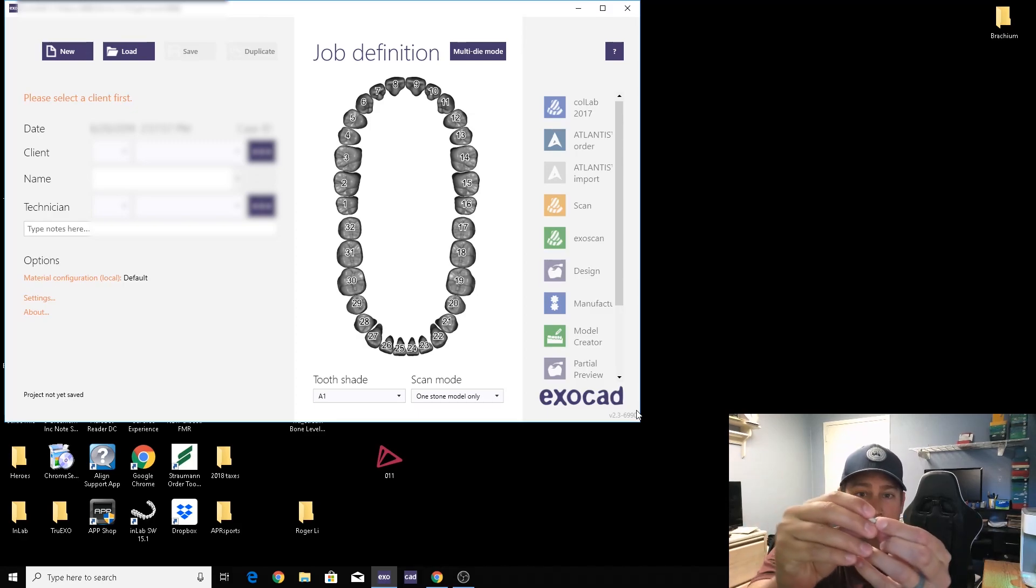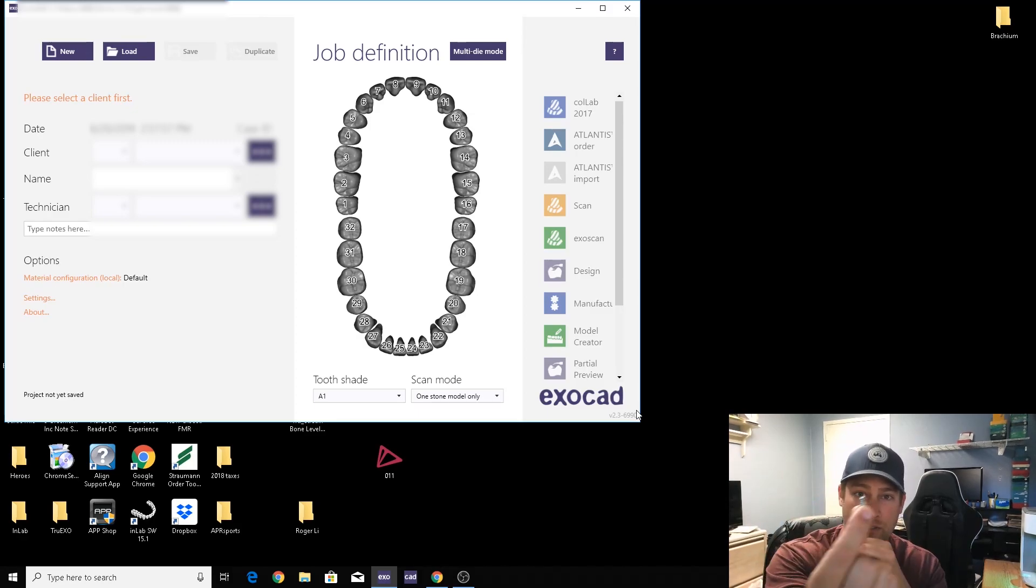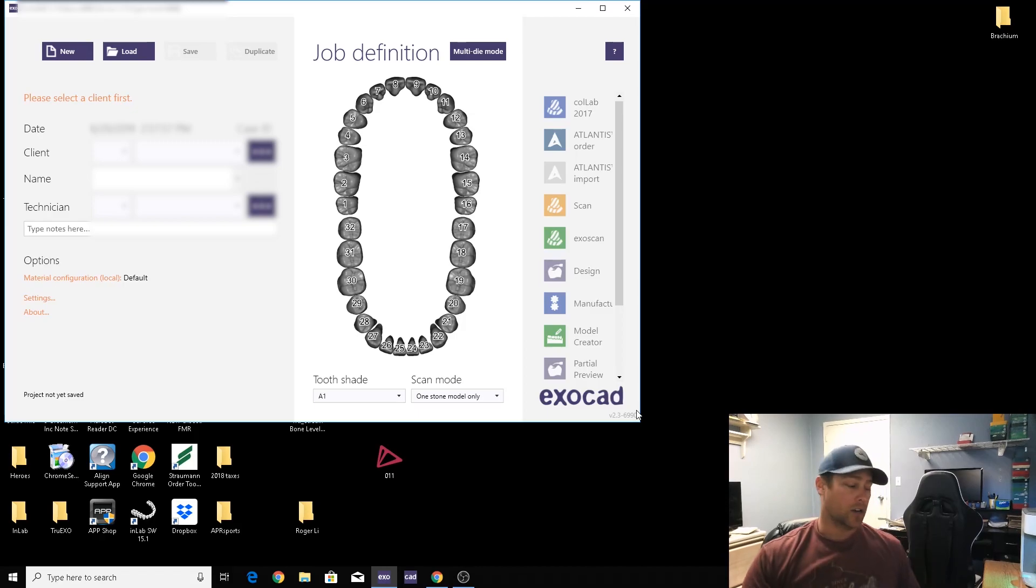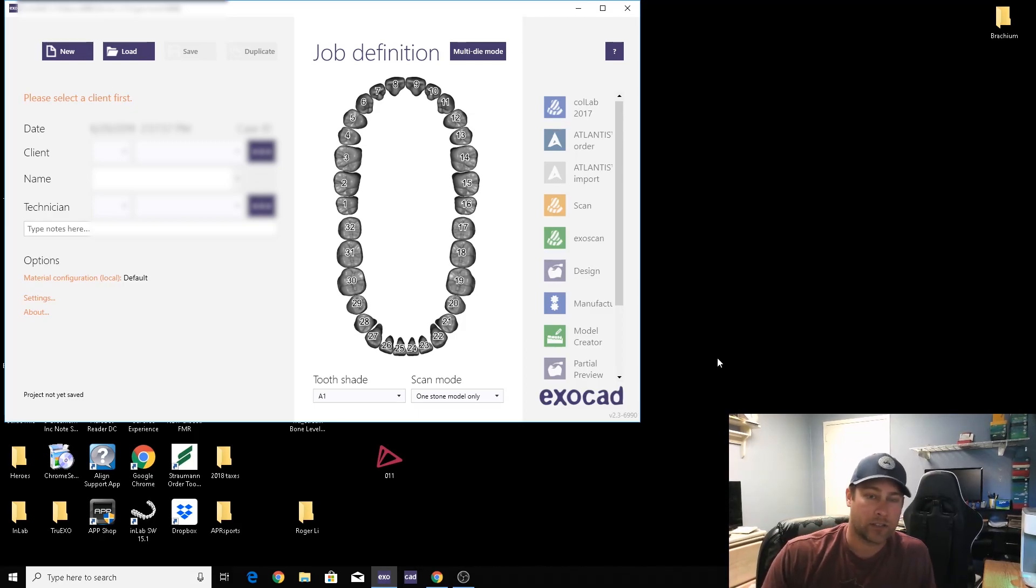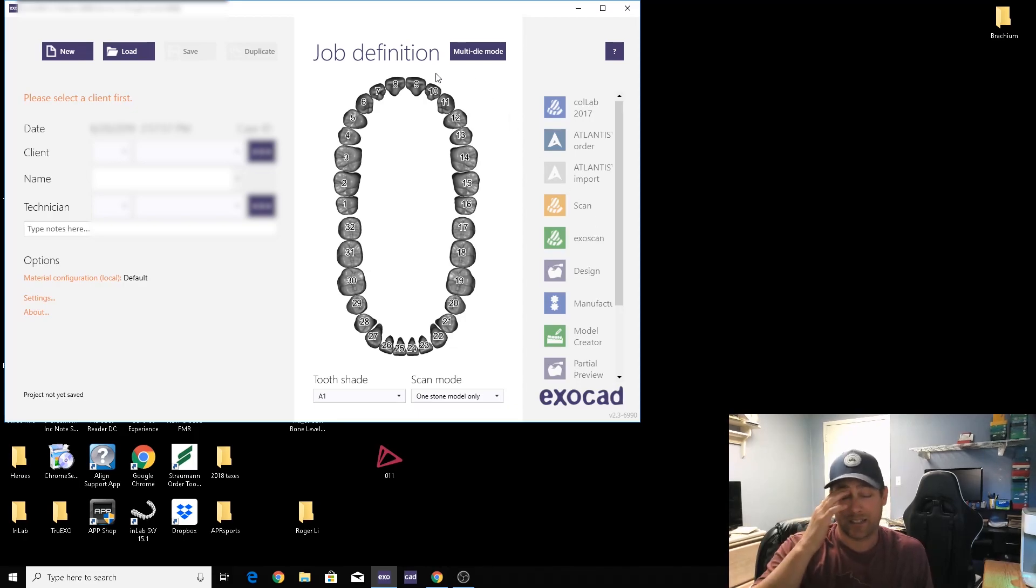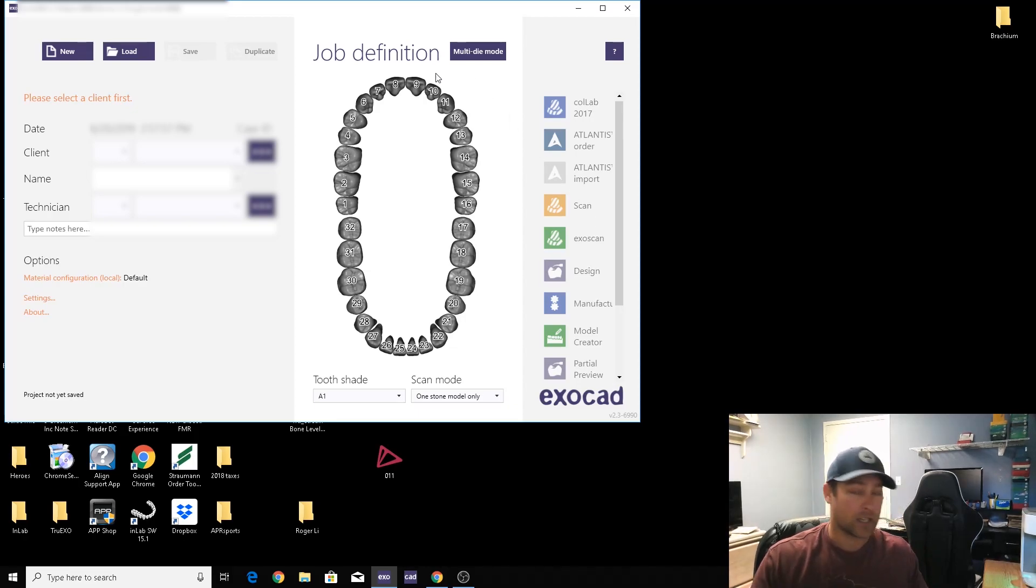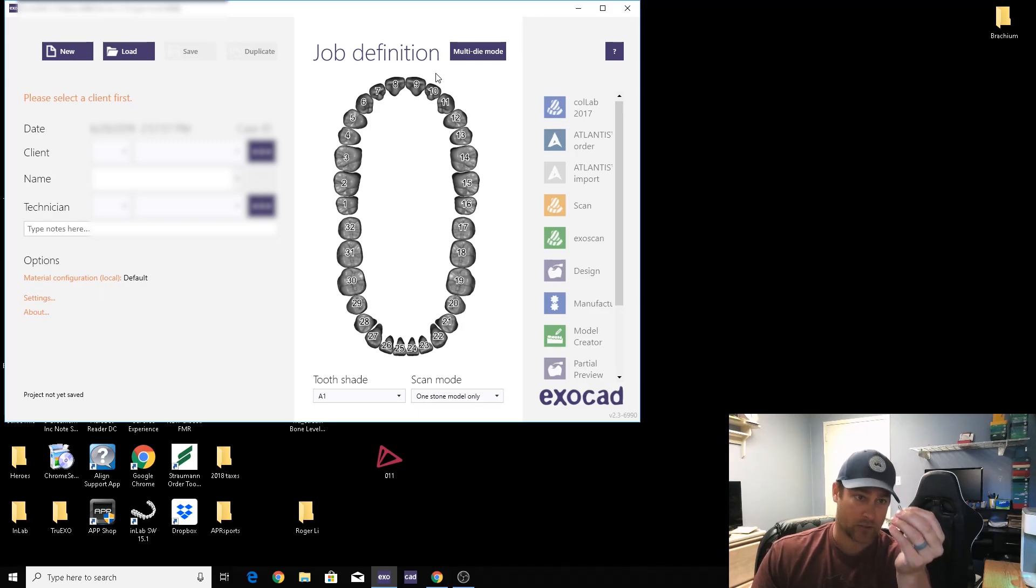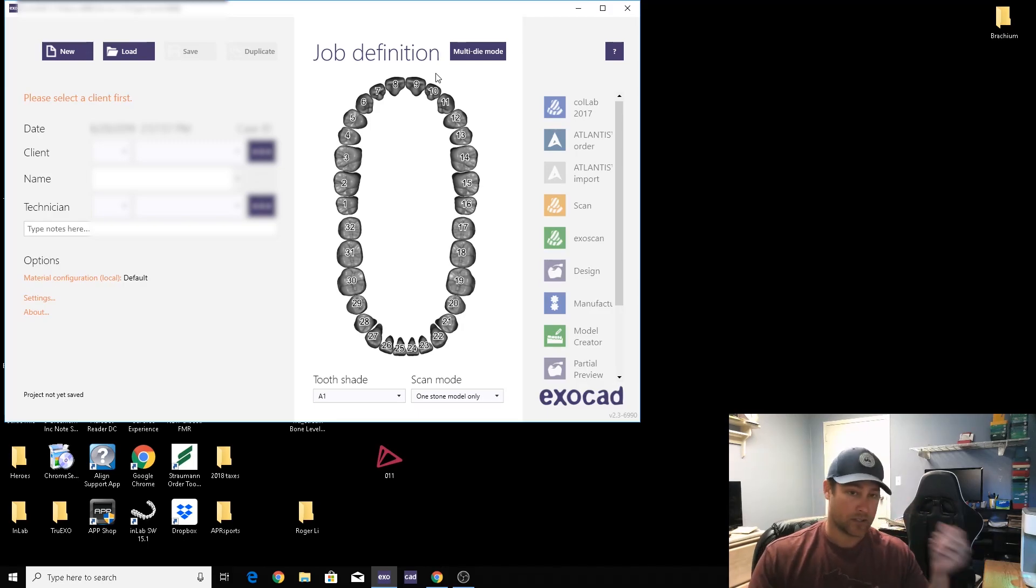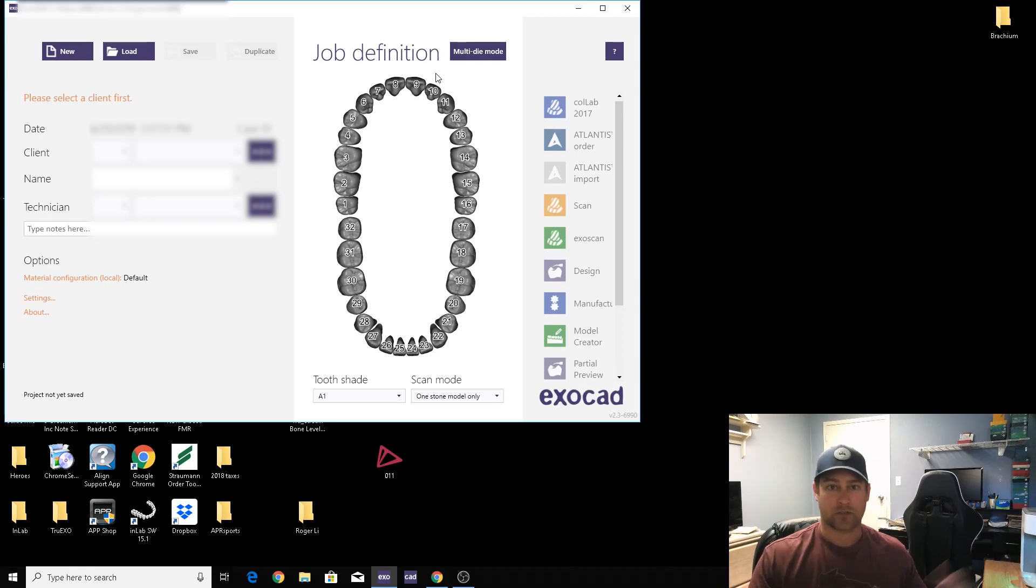At the middle interface, these scan bodies are basically transfer copings is what they are. They work exactly the same way. They all look the same, but the interface is all different.